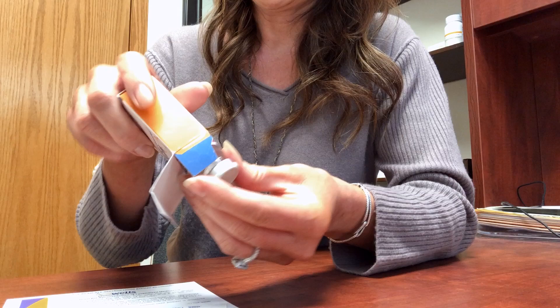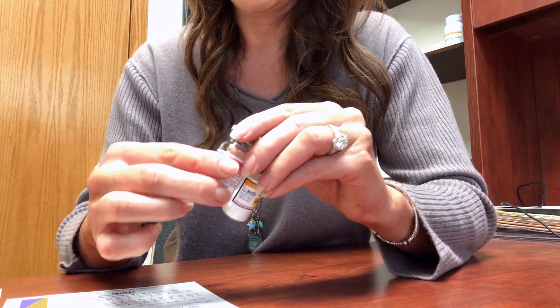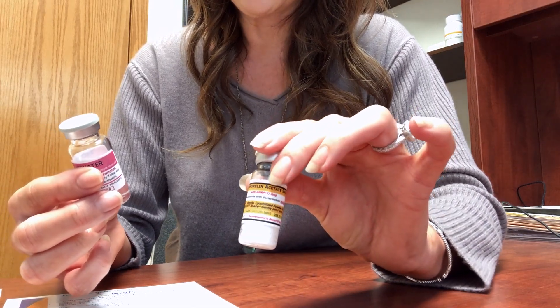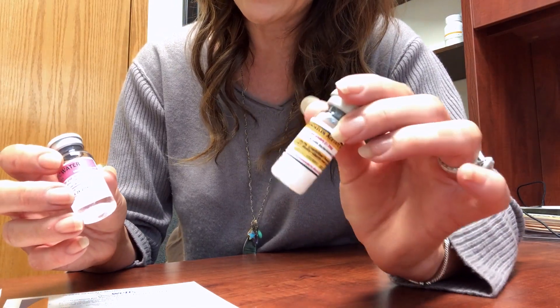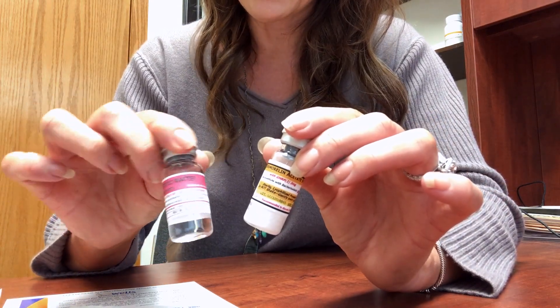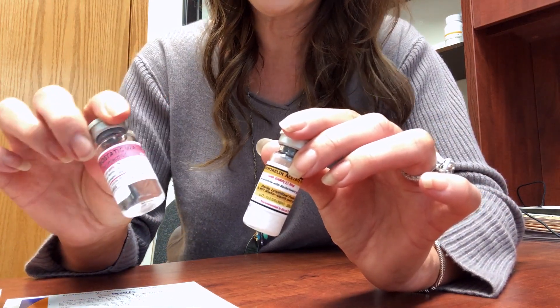Go ahead and open the medication. You'll see that there are two vials inside — one that contains the actual medication, the Sermorelin, and the other contains bacteriostatic water or sterile water.